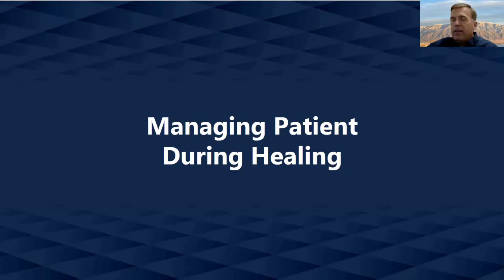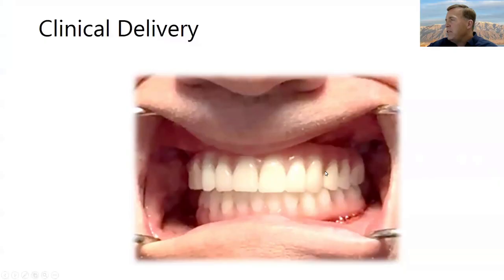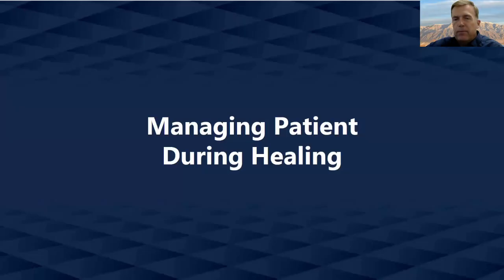And last but not least, if for some reason these restorations are really strong, they're printed with a material that's ceramic reinforced, they're stronger than a PMMA. So you shouldn't see a lot of breakage with this, especially if you have adequate restorative space and good implant spacing, like we talked about. But if there's a break between the implants, you have to repair it or you'll get implant failure.